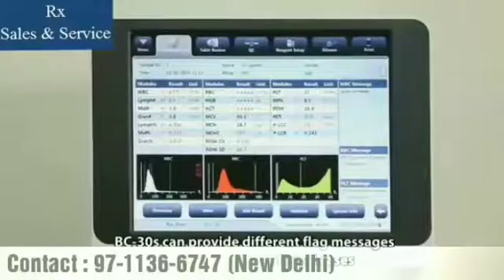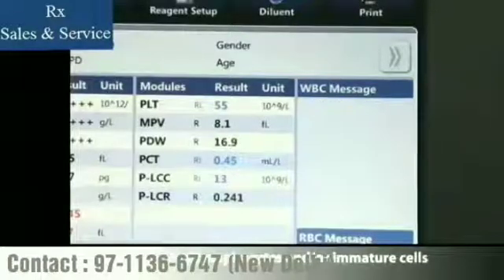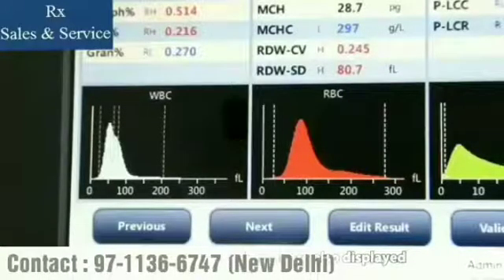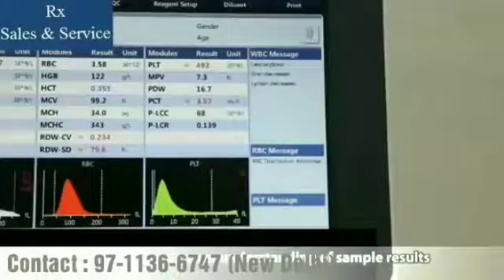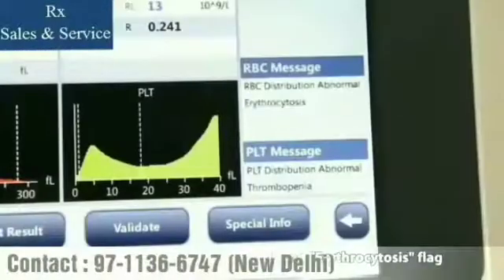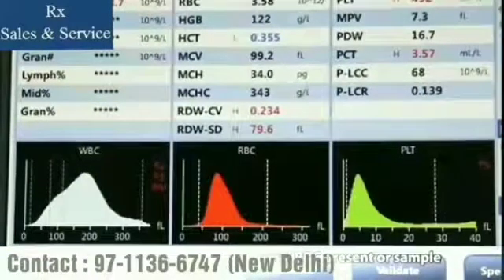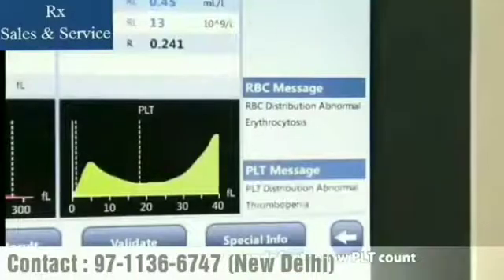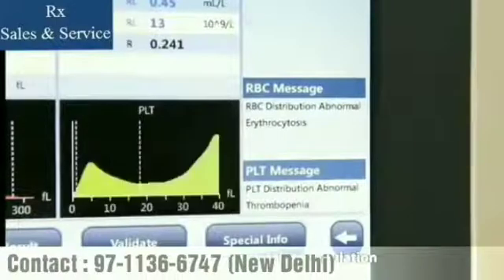BC-30S can provide different flag messages based on various clinical cases. For example, Lymph Increased means a high number of lymphocytes and/or immature cells; meanwhile, R2, R3, and RM flags are also displayed. RBC Distribution Abnormal and Erythrocytosis flags represent signs of abnormal RBC or a high RBC count. Thrombopenia stands for a low PLT count, and PLT Distribution Abnormal means possible presence of microcytosis, RBC debris, large platelets, or platelet coagulation.